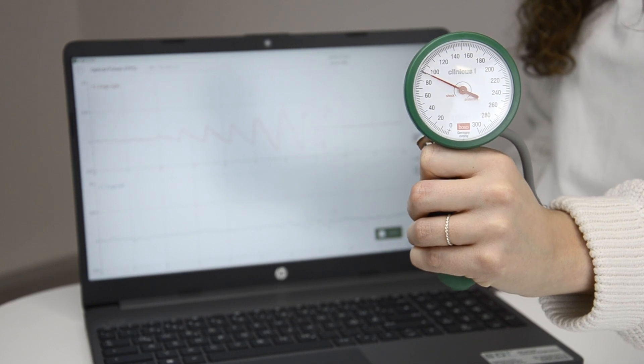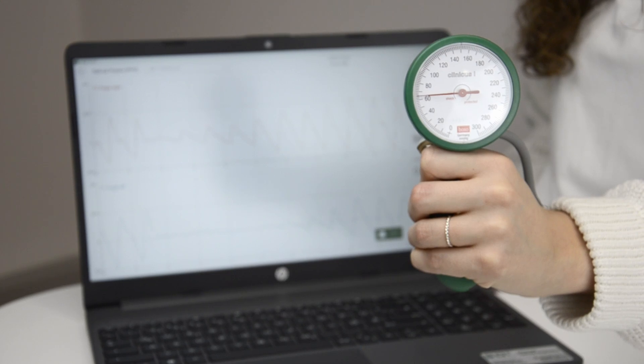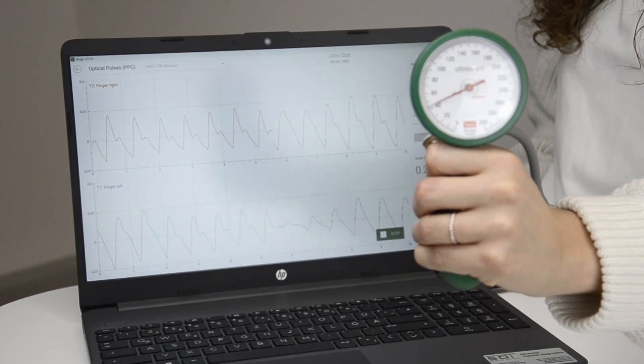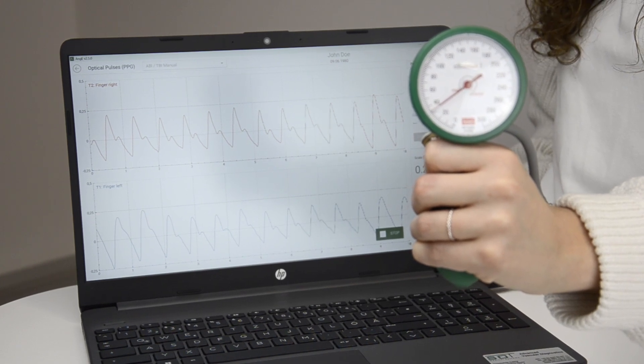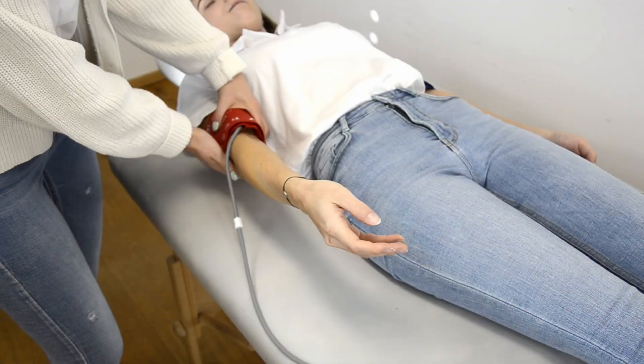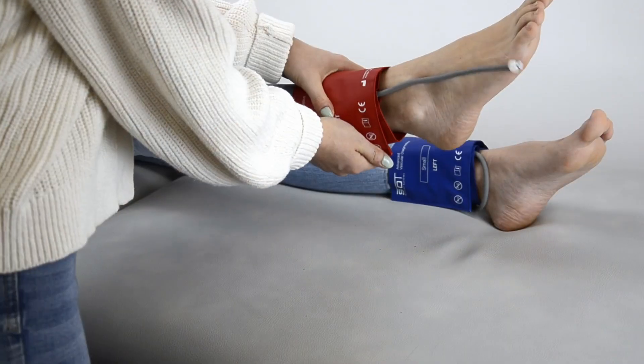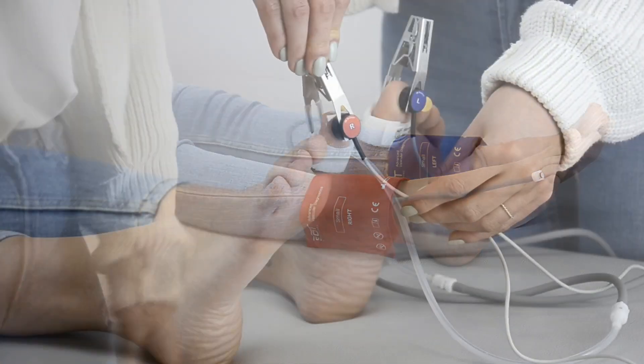If you are unsure about the recorded pressure, simply pump the cuff up again and release slowly to recheck the result. The pressures have to be noted for the left and right side individually. This procedure has to be done for upper arms, ankles and, optionally, for the toes.